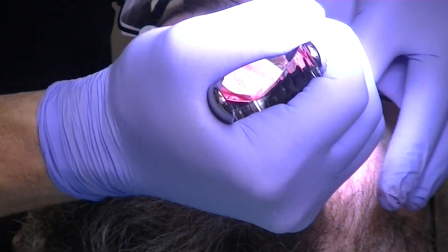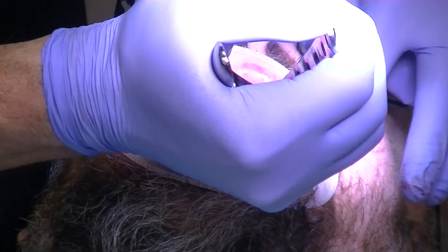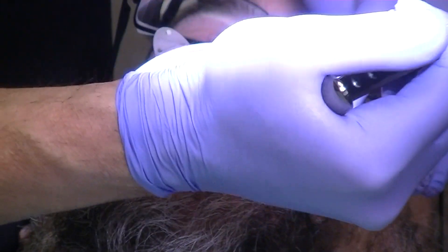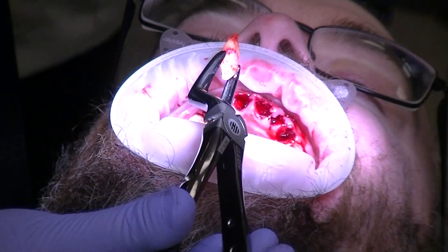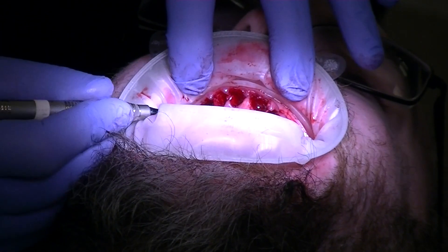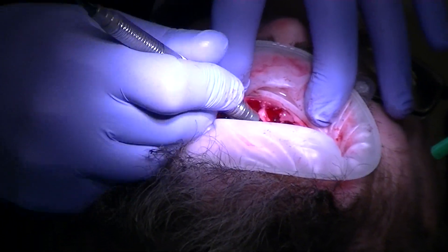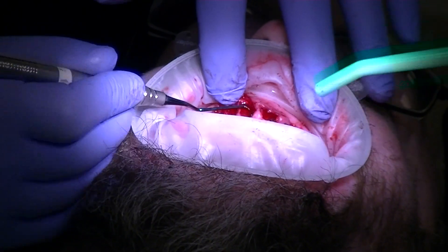We're just going to do our rotation. You can push in a little bit just to expand the socket, then keep rotating. I don't like to go buccal-lingual and break the bone — just rotate within its socket and it will come out in one direction. You can see all the decay in that tooth. Suction that piece — thank you. Everybody can see the size of this root. We want to curette the socket, and notice I'm pushing on the facial — the thin buccal plate is still there.